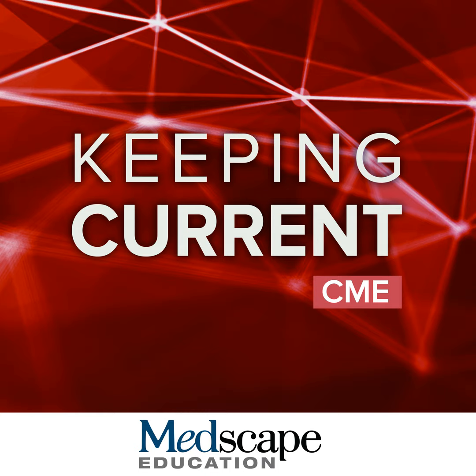But what if they have repeated visualization score Cs? Well, that's when the LI-RADS surveillance talks about these alternative screening methods. So you may be asking yourself, what are these screening methods? Well, for one, you can just do liver MRI. You can do a full contrast-enhanced liver MRI, but we know that's expensive. You can do CT, which has radiation, and so now you're exposing these patients to repeated radiation. So to combat these things, these abbreviated MRI protocols have been developed and studied over time.